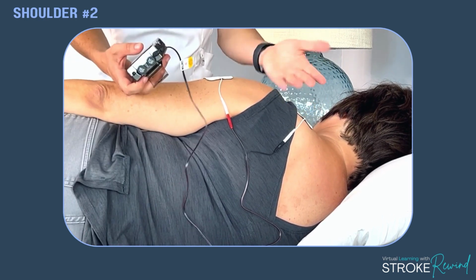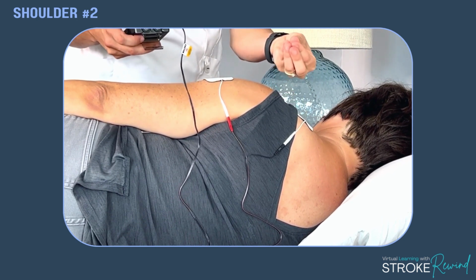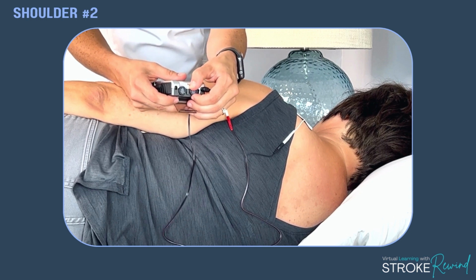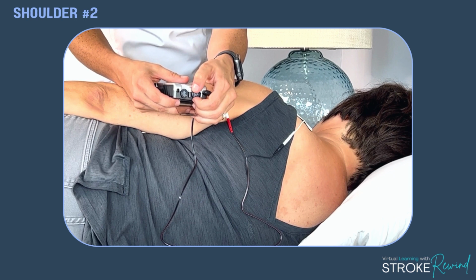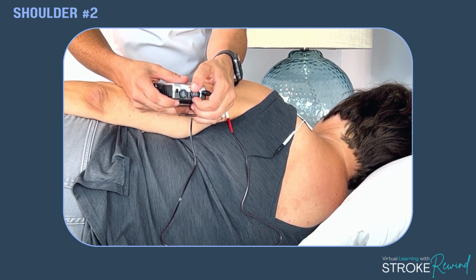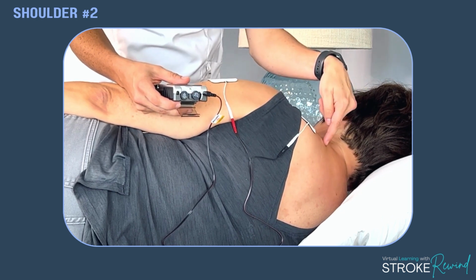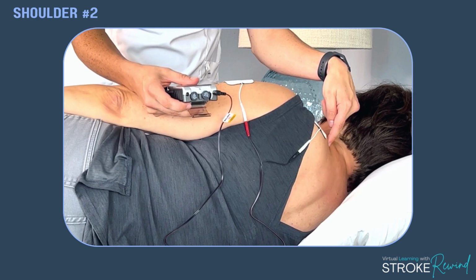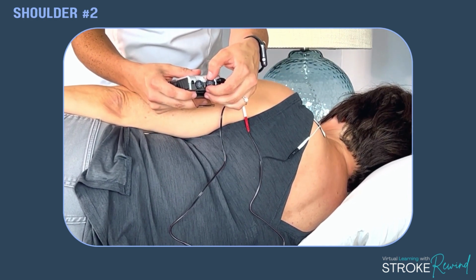Again, you're going to ask them if it feels comfortable as you turn it up, and then once they feel something, you're going to go for a movement. So let's start with turning it up. Let me know when you can feel it. I can feel it. Okay, and now we're going to start to move it. Oop, can you see that? What incredible movement. Does that hurt? No. Okay, that's the second placement for the shoulder.